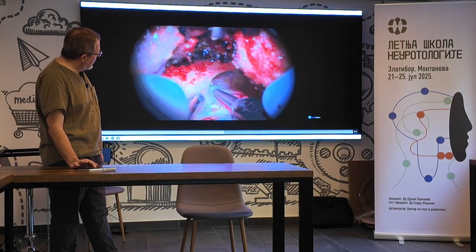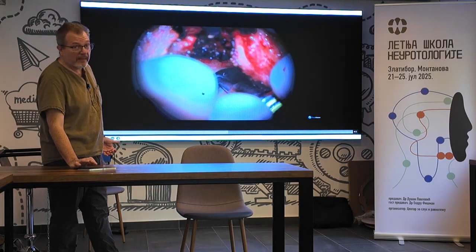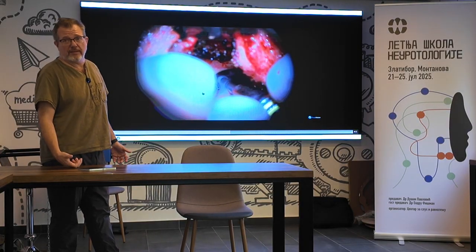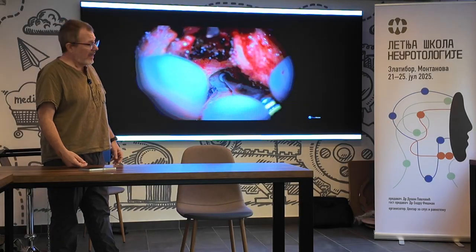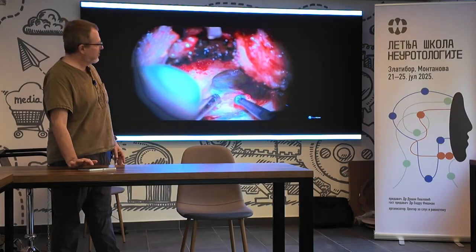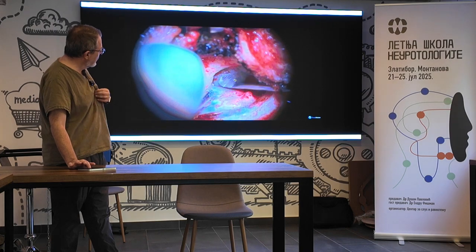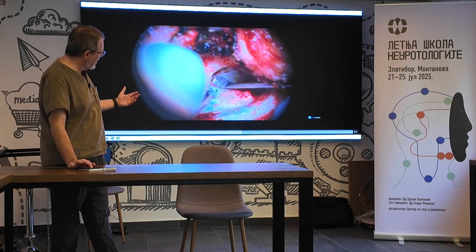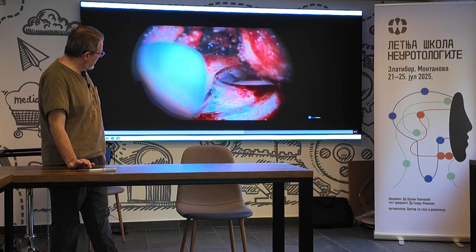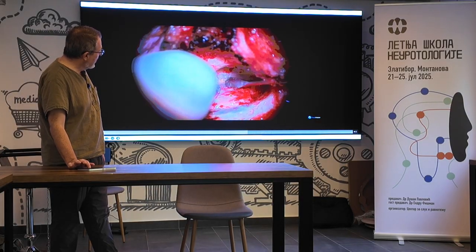If one accidentally exposes the posterior canal, you can plug the posterior canal, just like a superior canal, and they may have some vertigo from this, but it won't cause hearing loss. And many of these patients already have some hypofunction. This one didn't have much hypofunction, but that is also recoverable. So see, you have to take all of the bone off.